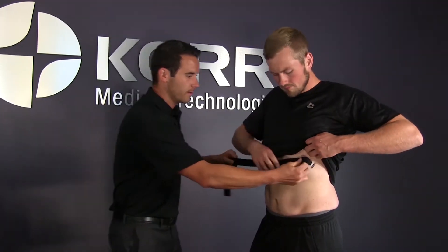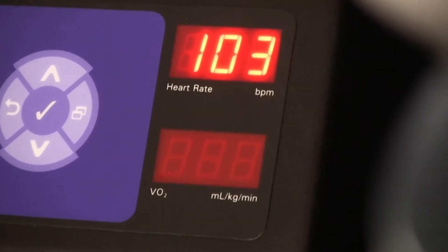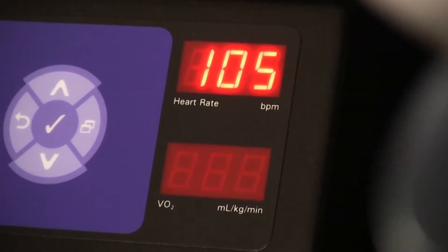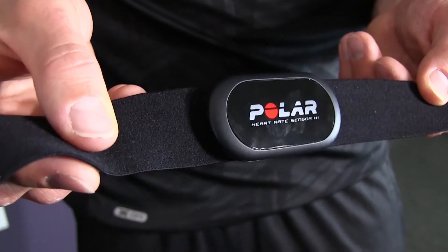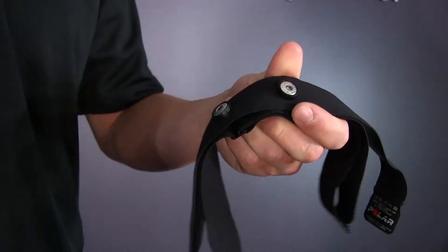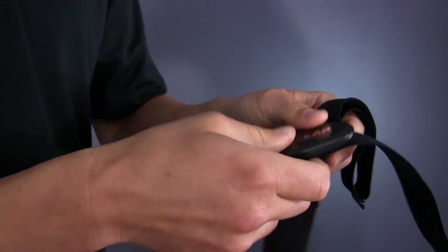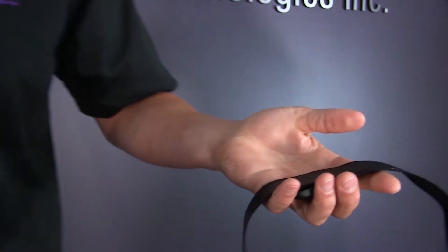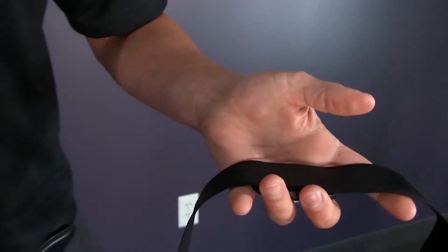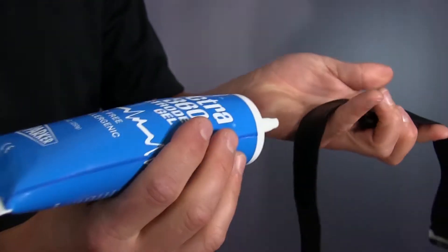Now we are ready to start testing. For a graded exercise test, we'll start by fitting the client with a properly fitted heart rate strap and heart rate pickup. This is important because an accurate measurement of the heart rate will lead to better results. Note that CardioCoach uses Polar technology. Locate the heart rate chest strap and attach the Polar heart rate transmitter to the elastic strap — you will hear the sensor snap into place.